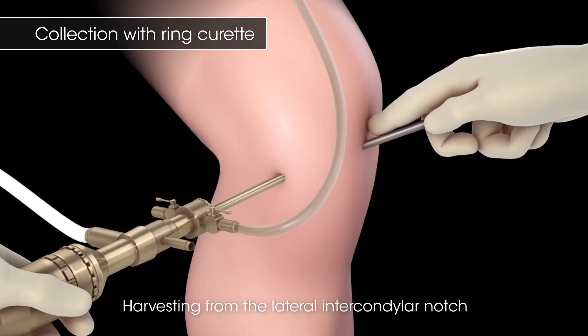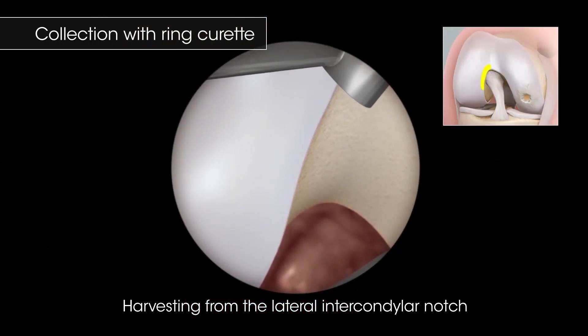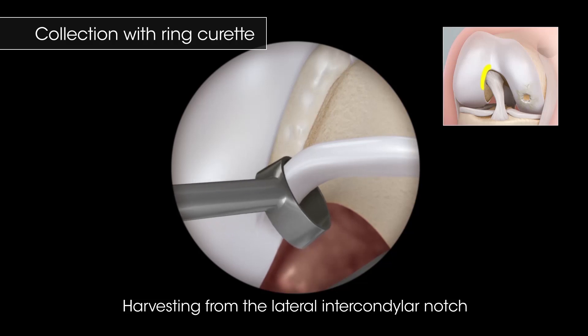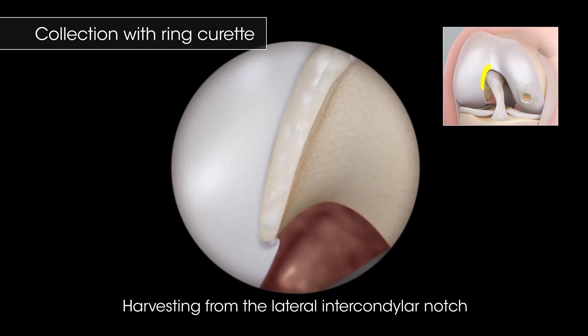When harvesting from the lateral intercondylar notch, use the back edge of the open curette to penetrate the cartilage down to the subchondral bone. Advance up the side of the notch by slightly pronating and supinating the hand while keeping constant pressure. Leave the distal end attached and remove the tissue with an arthroscopic grasper.